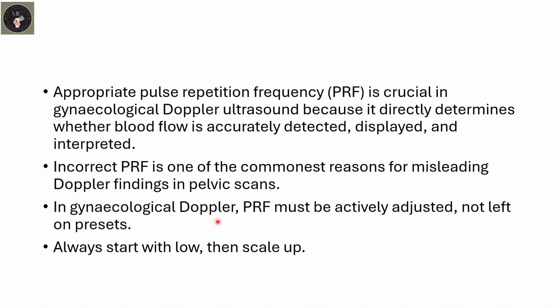But the principle is that you start low and then scale up. Start from 0.03, scale to 0.06, and to 0.09. In most cases, within this range, one will be able to pick blood flow in gynecological lesions.